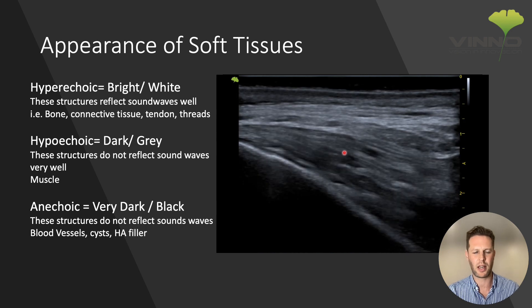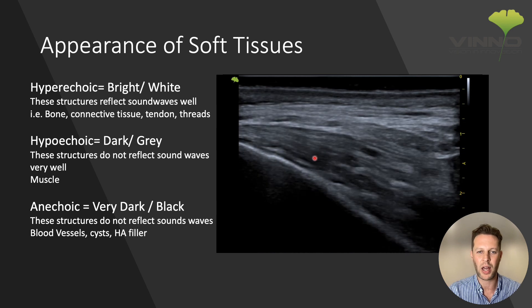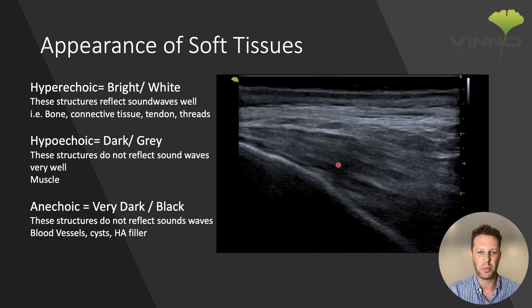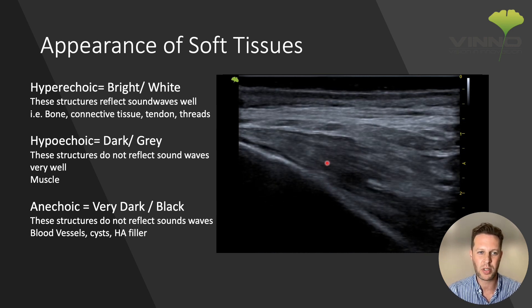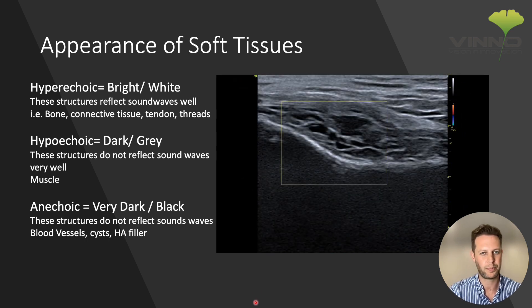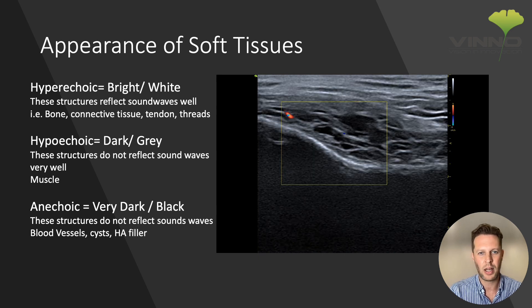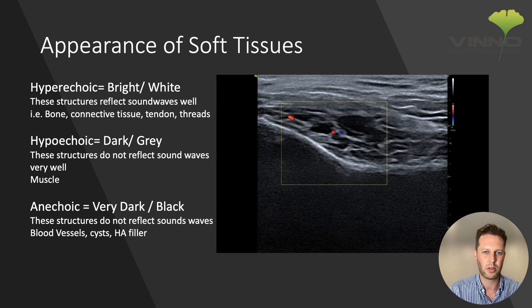Anything that lets the sound wave completely pass through it, such as fluid, cysts, or even HA filler, is going to appear black or very dark on ultrasound — we term that anechoic. HA filler can be seen in the same temple region as these little blobs of anechoic structures. If we play that, you can see that it looks different to the surrounding muscle tissue.